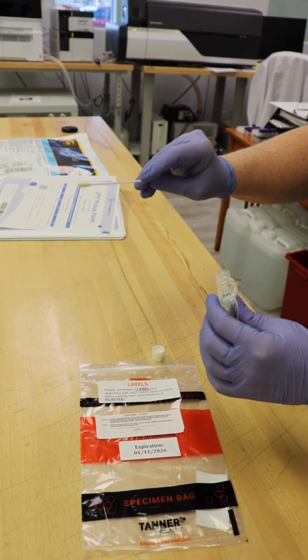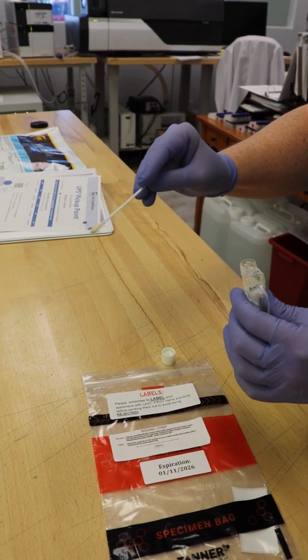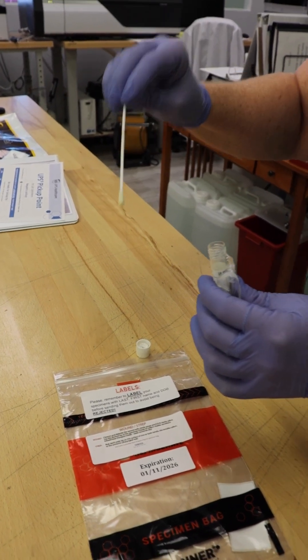Use the sterile swab provided to gently rotate within the area of the viable wound tissue, applying enough pressure to express fluid immediately.